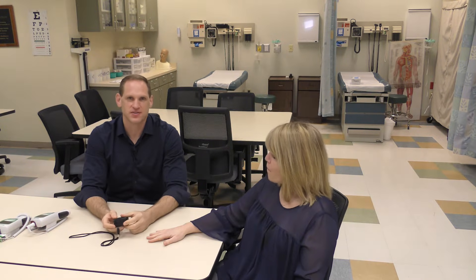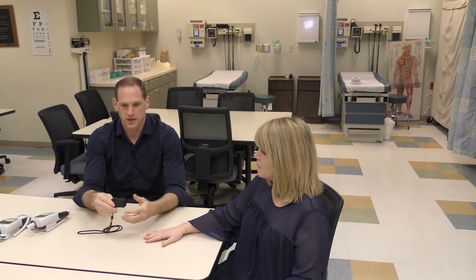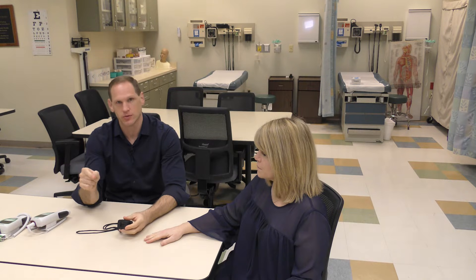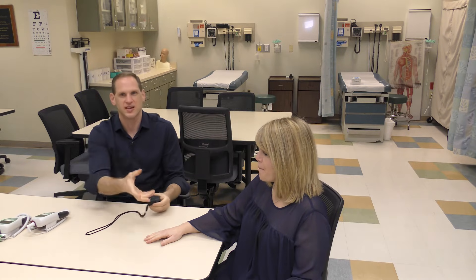Now we're going to talk about pulse oximetry. Pulse oximetry measures the percentage of hemoglobin that is saturated with oxygen, sometimes known as O2 SAT. It's abbreviated SpO2, which is different from SaO2, which is obtained when you do an arterial blood gas and actually withdraw blood from the patient. SaO2 numbers will always be a little bit lower than SpO2 numbers because as soon as you take the blood out of the patient, oxygen begins to escape into the atmosphere.